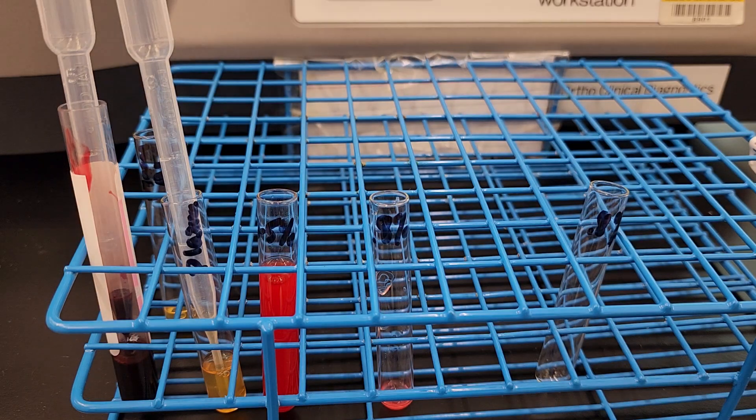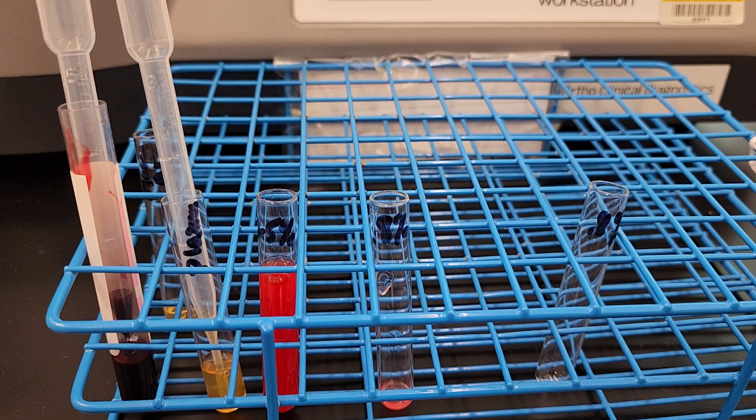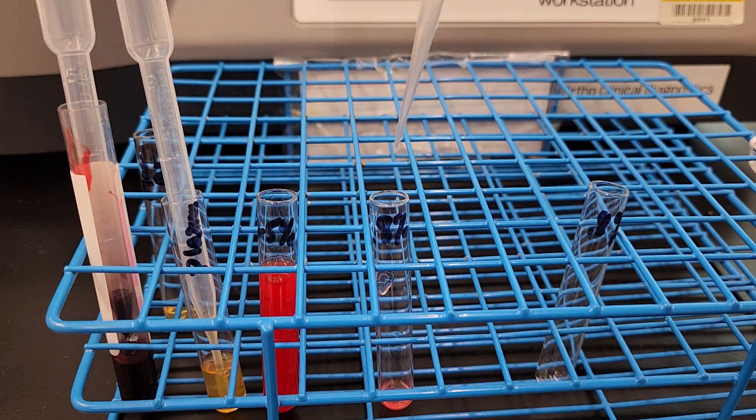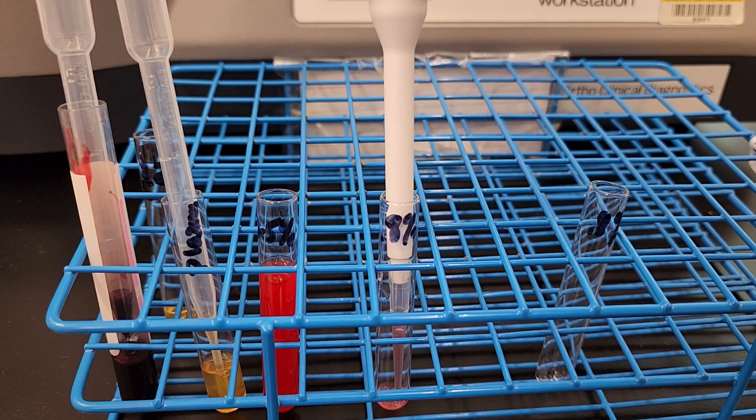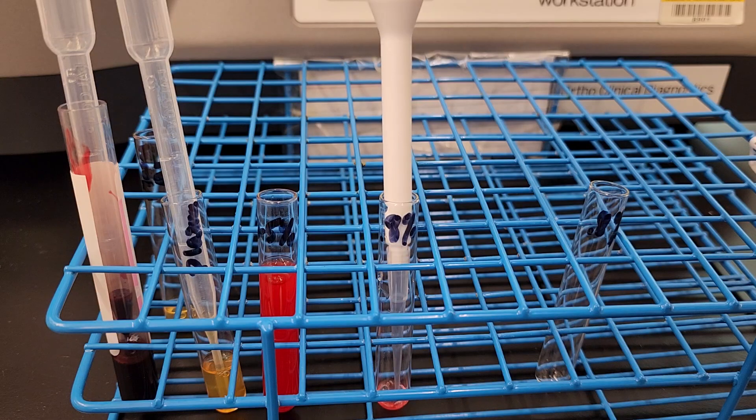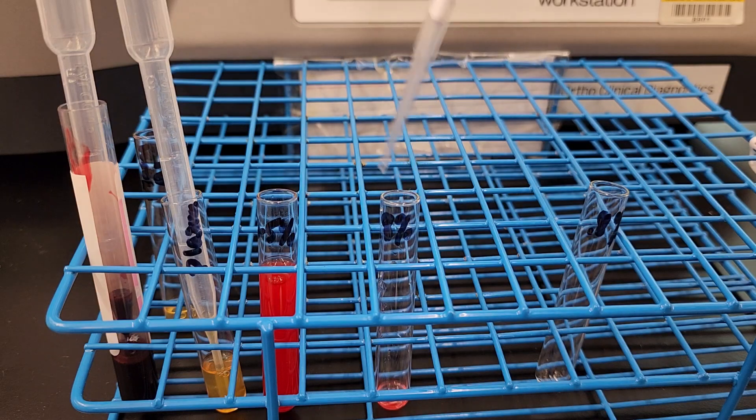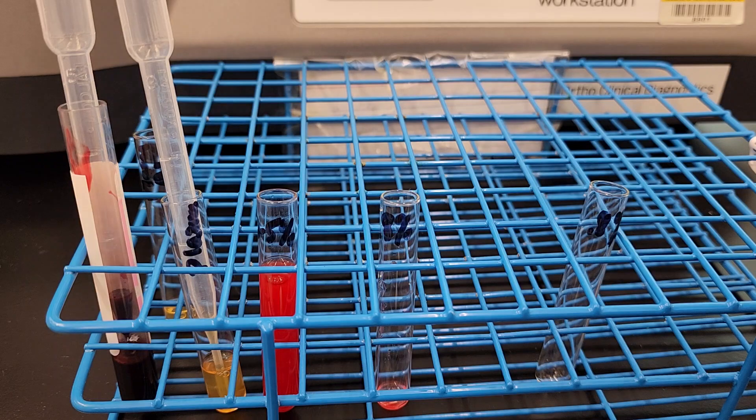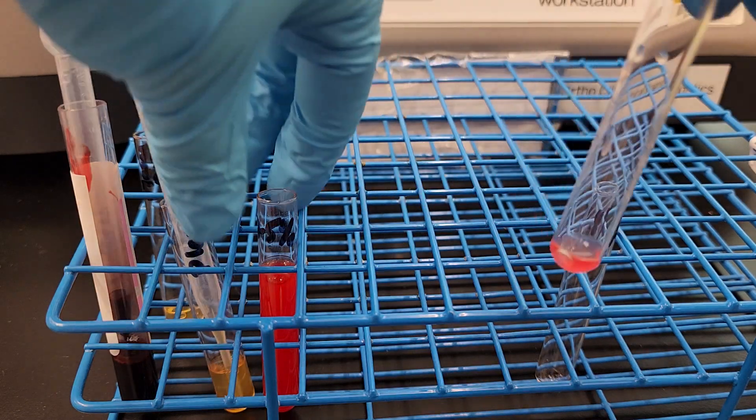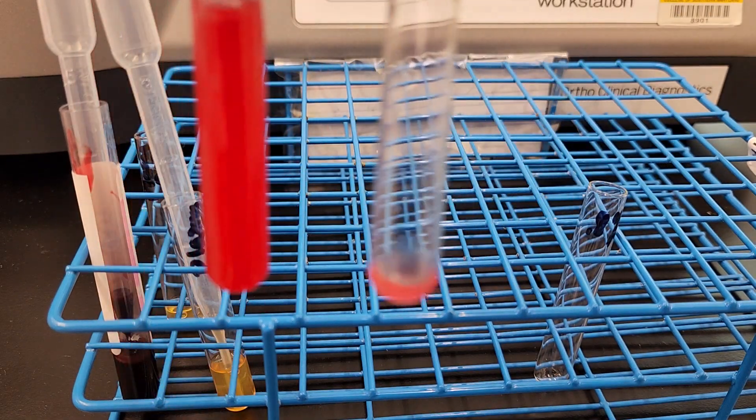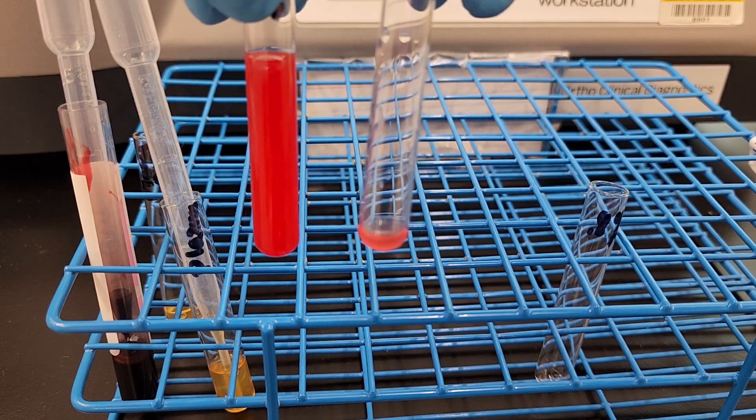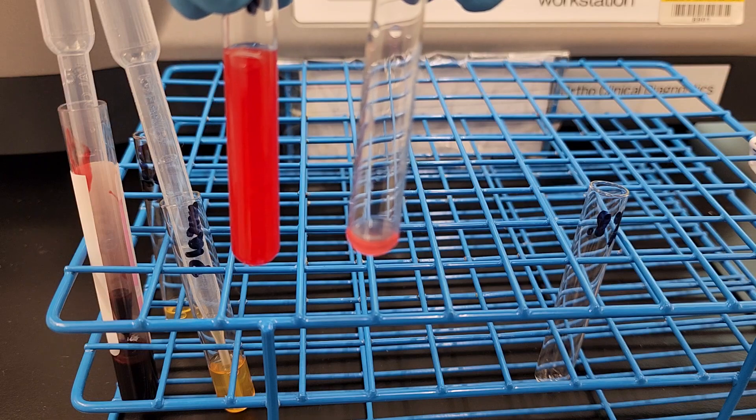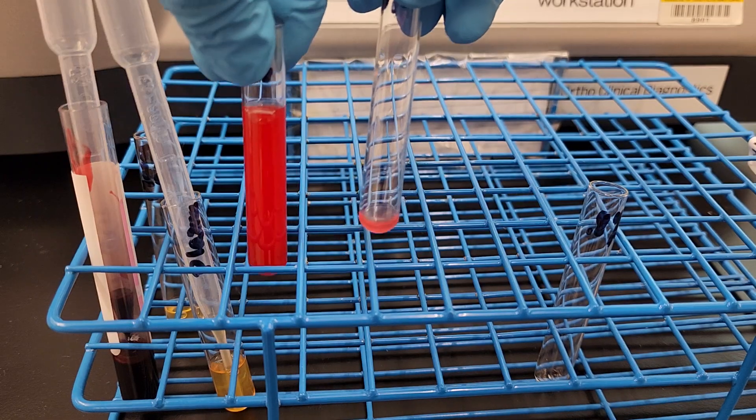All right, and I can still use the same tip if I wanted to in order to re-suspend. And eject the tip off. Okay, so now what you're going to see is look how much lighter that is. Obviously, it's a less amount, but we went from a 3% to 5% to a 0.8%, all right?